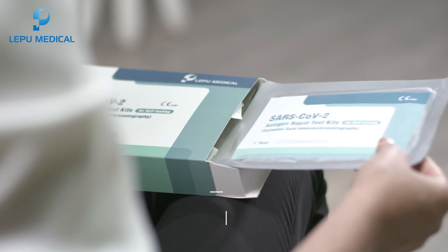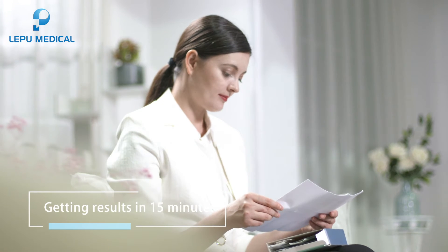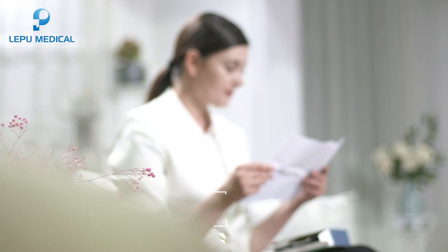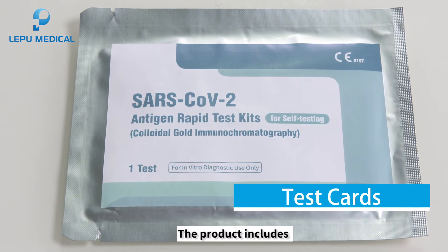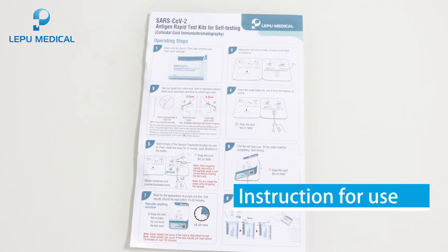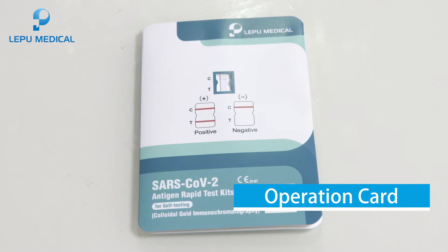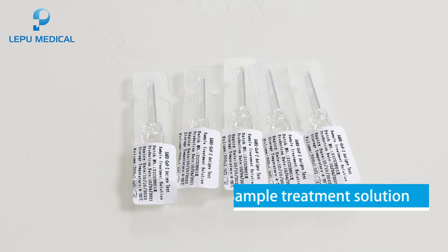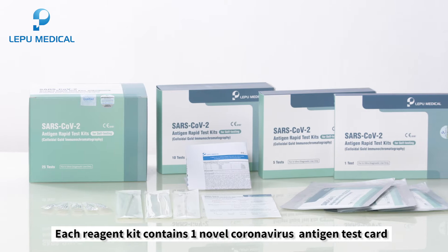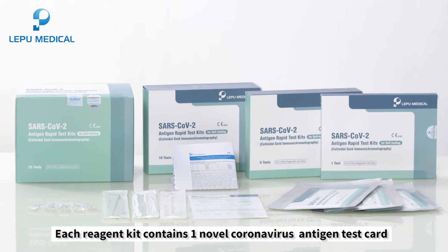It is simple to use, no prescription needed, getting results in 15 minutes, stable with high accuracy. The product includes test cards, instructions for use, operation card, disposable sterile swabs, and sample treatment solution. Each reagent kit contains one novel coronavirus antigen test card.